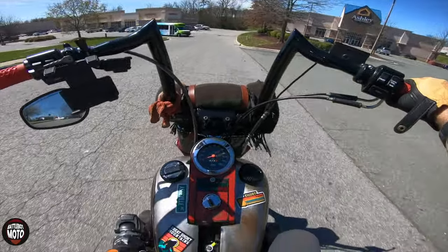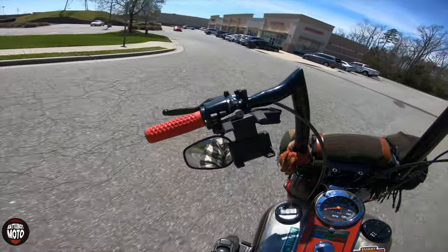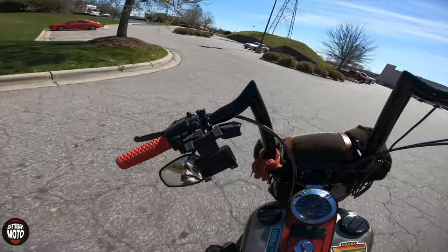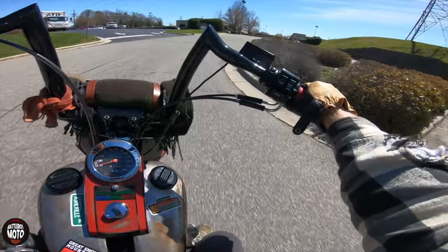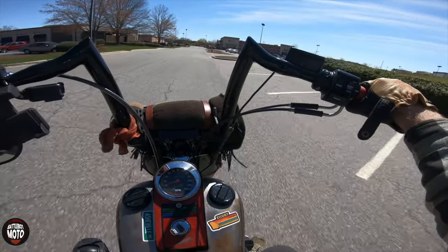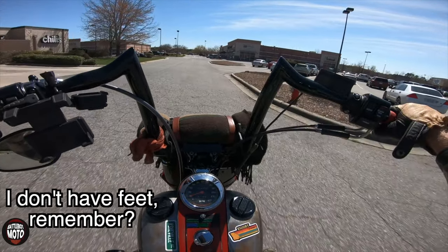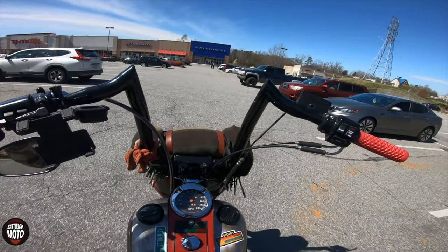I shift my dirt bikes with my hands. There's no heel-toe shifting on those, it's all toe, and that's a lot more difficult for me so I just reach down. I ride a little Kawasaki 110, so it's not a big bike — I can just reach down and grab the pedal with my hand. I'm also currently in the process of figuring out different ways to shift.